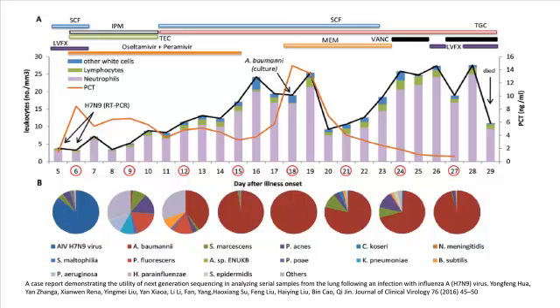And then these circles correlate the different bacterial pathogens, the percentage of bacterial pathogens retrieved from those samples. As the patient progresses over time with antibiotic treatment, there are different numbers of bacterial pathogens in different percentages, and it progresses toward this bacteria species here. But again, depending on when you look for it, you find different agents. And then ultimately the patient died.